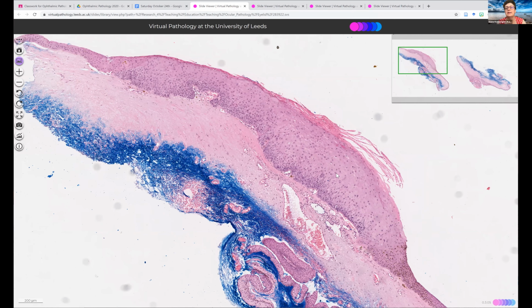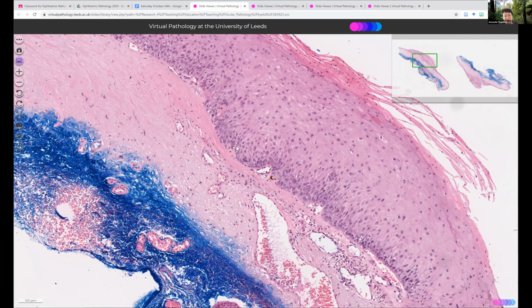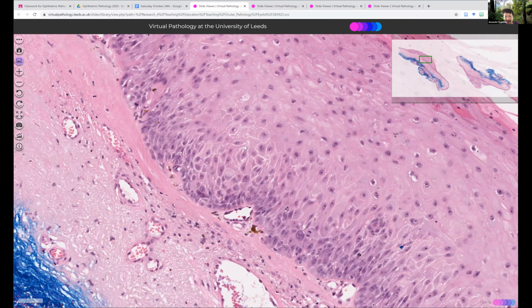The next question is, are there any intercellular bridges? I think there were. Oh, yeah, quite good here. Okay, here's some. This dysplastic cell with 3 nuclei and 3 nucleoli is surrounded by a white space with the little prickles, which represent the remaining intercellular junctions held together by desmosomes, which are little spot welds, which make the legs of the prickles. And yes, there are intercellular junctions, prickle cells, which is a feature of squamous cells, squamous differentiation.